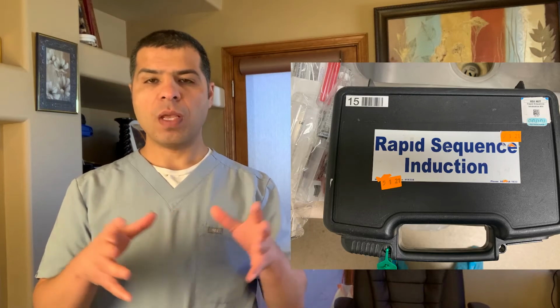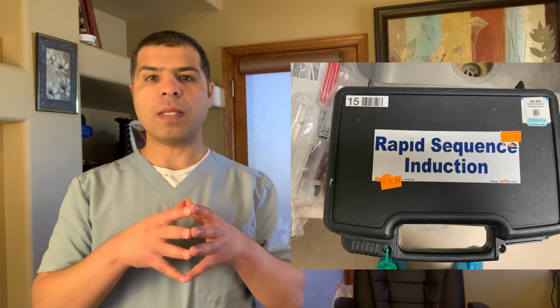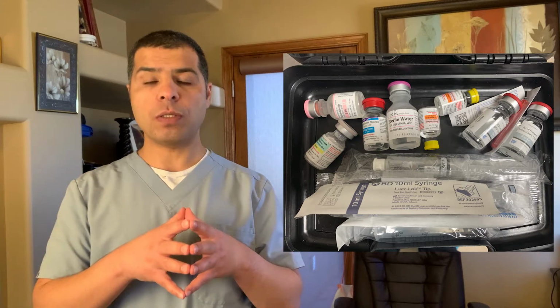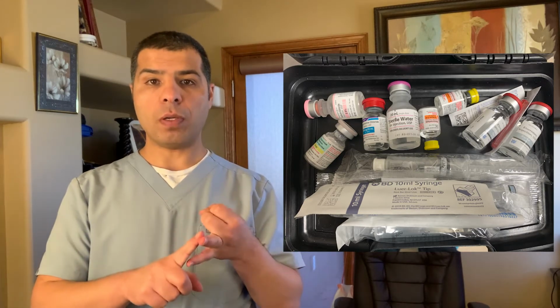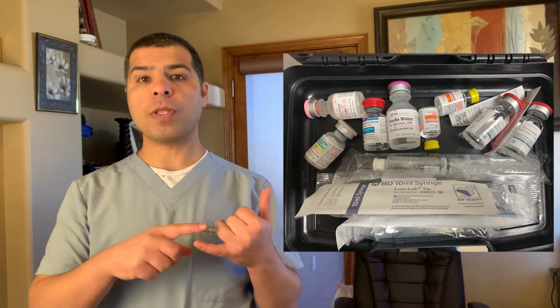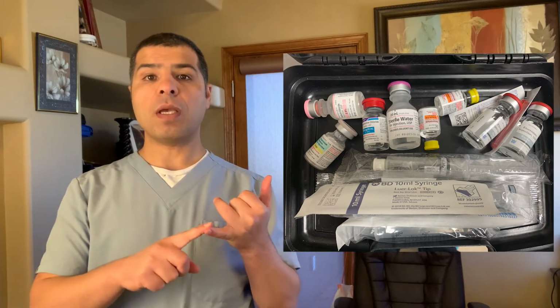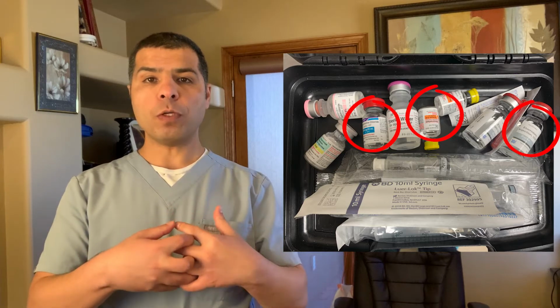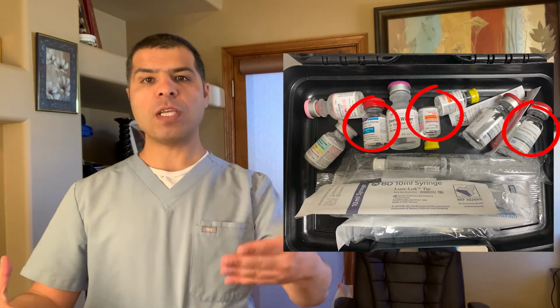Now, it's very important that you familiarize yourself with what your facility's RSI kit contains. The RSI kit is a kit that has the medications required for rapid sequence intubation, the sedatives and paralytics. In my institution, usually they have etomidate, rocuronium, and succinylcholine in the RSI kit. So it's very important to know what your RSI kit contains so you pick a medication from that kit.